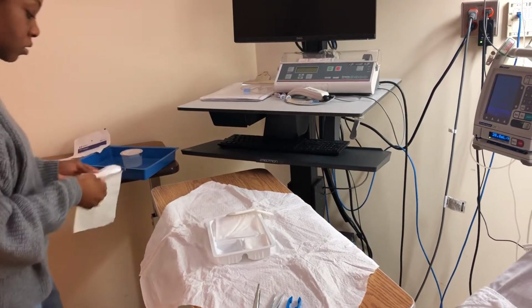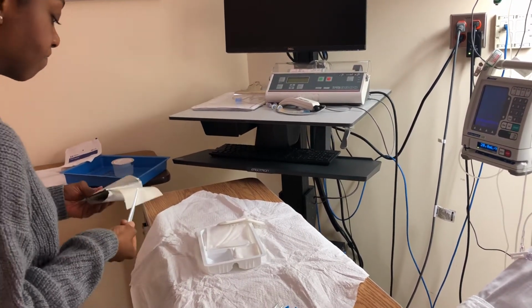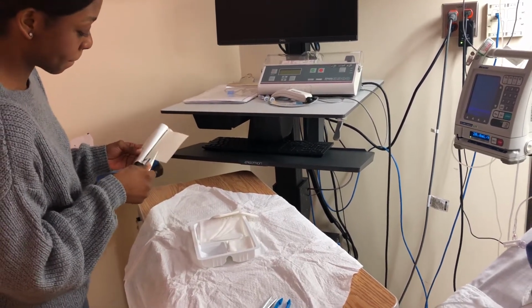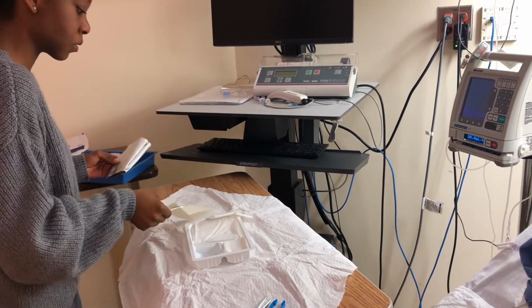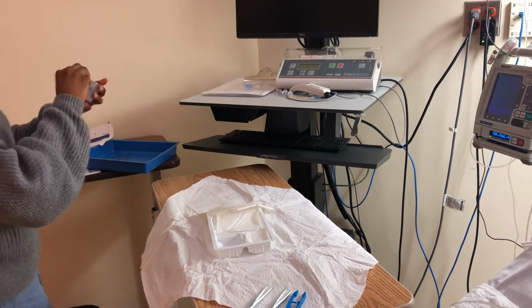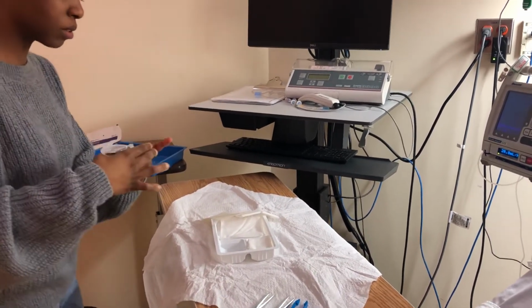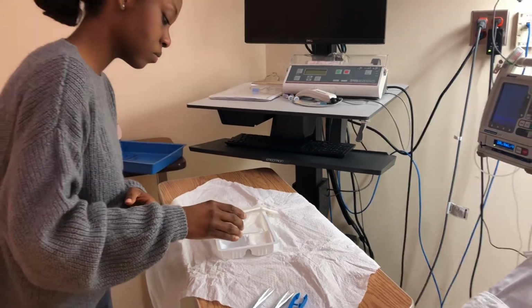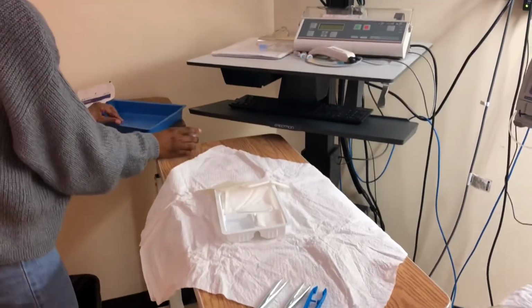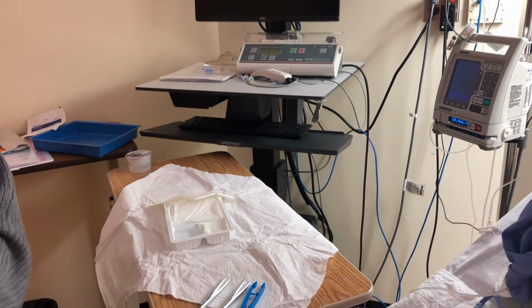Open my jelly net next. Just leave the jelly net here. And then my... so I'm gonna pour my normal saline. So now I'm going to wear my gloves and remove the old dressing.